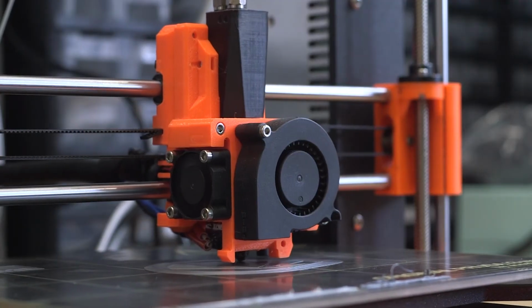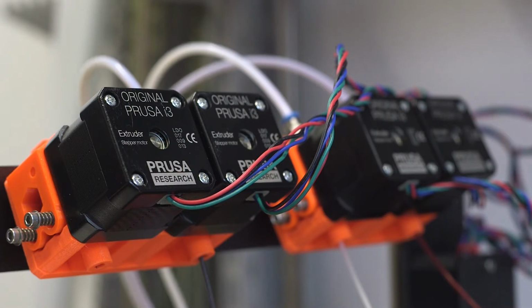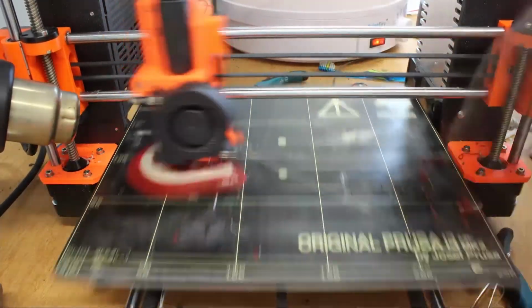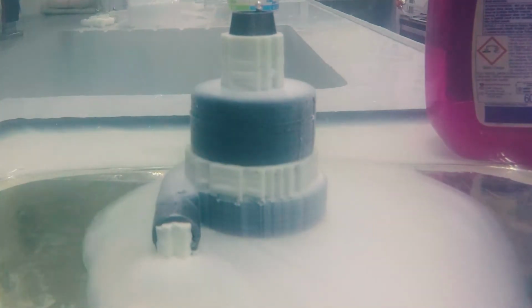The printing process is done on a conventional FDM printer with multiple extruders. We slice the model, and then in each layer the printer changes the filaments to print different materials in different areas. To support overhangs or to fill gaps, we use a water-soluble material that will be removed after the print.